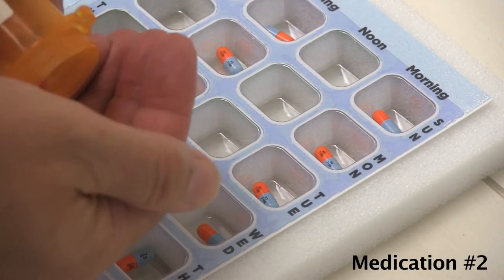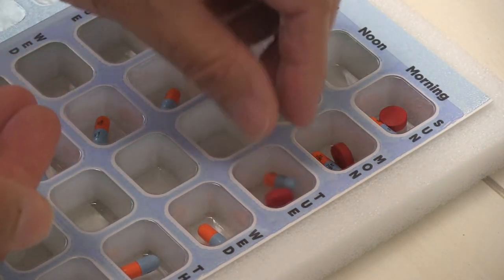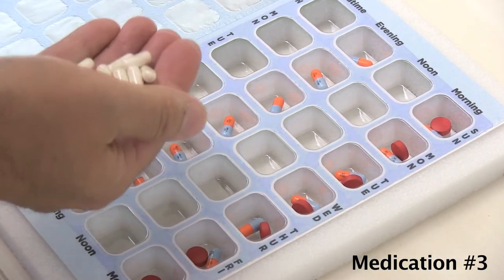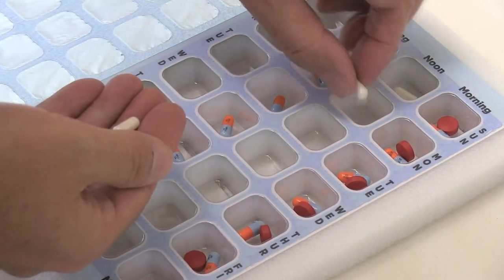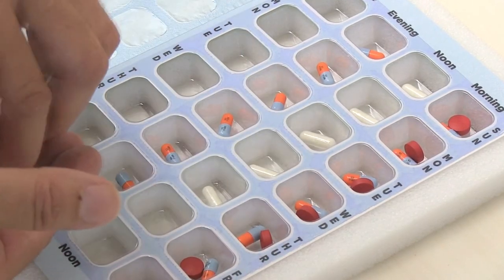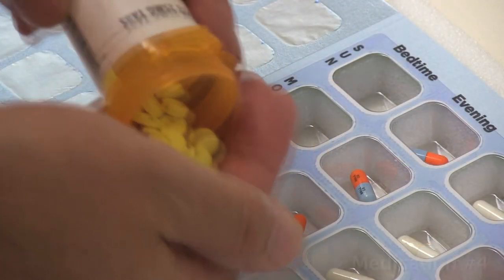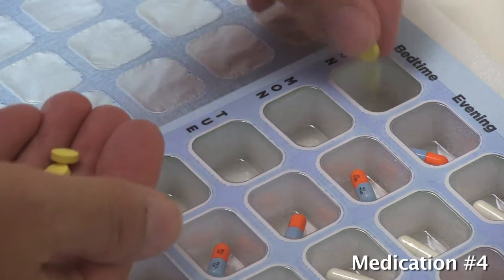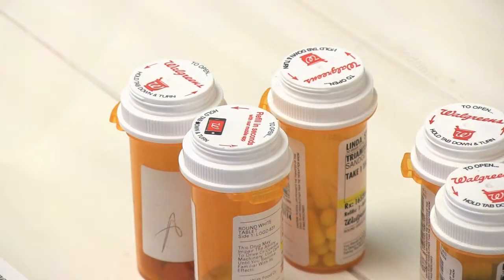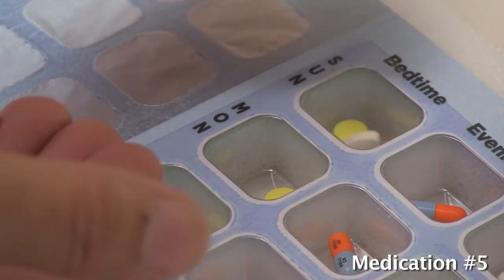Our second medication is taken in the morning. Our third medication is taken at noon. Our fourth medication is taken at bedtime. Our fifth medication is also taken at bedtime.